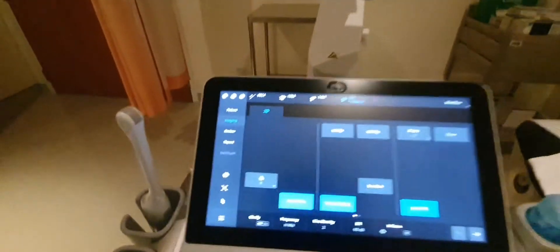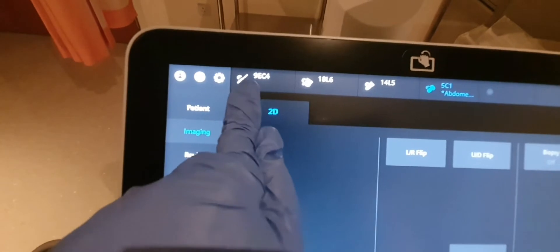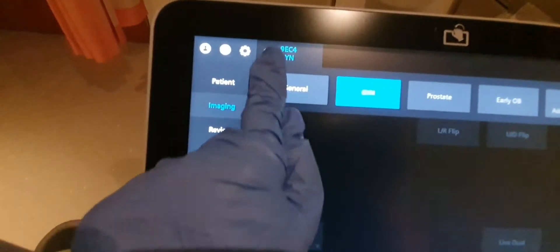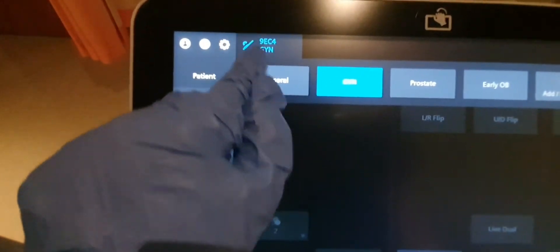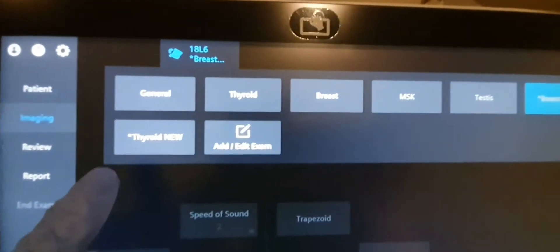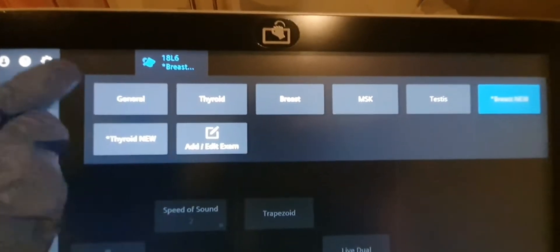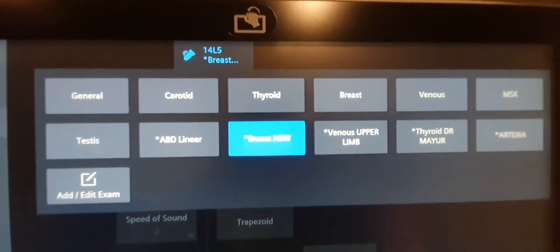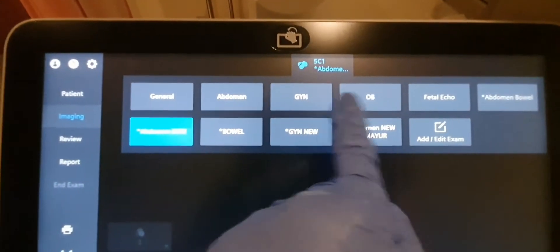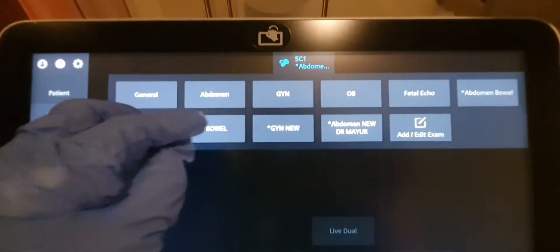Now you need to select the probe you're going to use. We have the transvaginal probe, the linear probe, and the curvilinear probe. For the transvaginal probe you can select gynaecology. For the linear probe we have thyroid, breast, and MSK — mostly for small body parts. For the curvilinear probe we have general ultrasound, gynaecology, and OB.